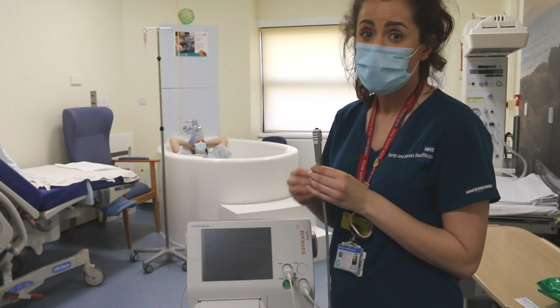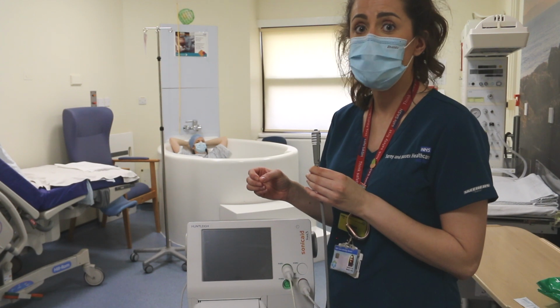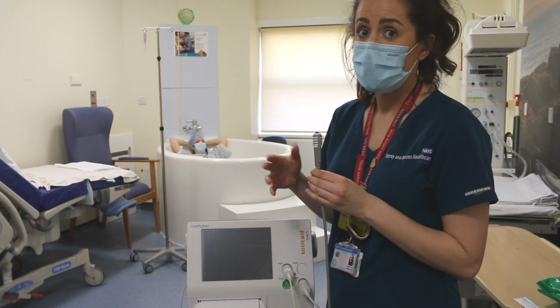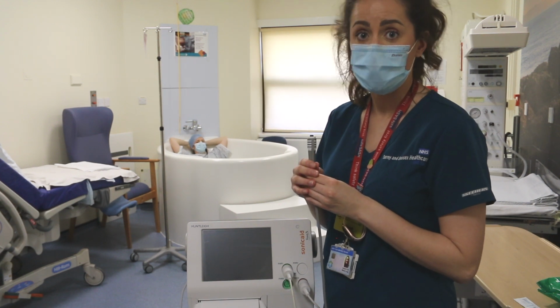And what will happen is that will register on the CTG machine and on the CTG trace. If this is not in use, it will affect the Dawes-Redman analysis, and as a result it may lead to the criteria not being met as quickly as it would.